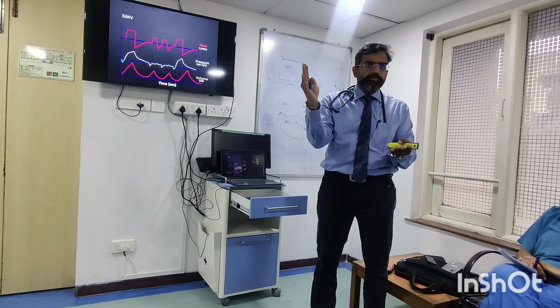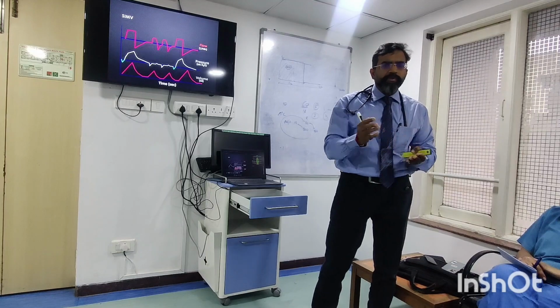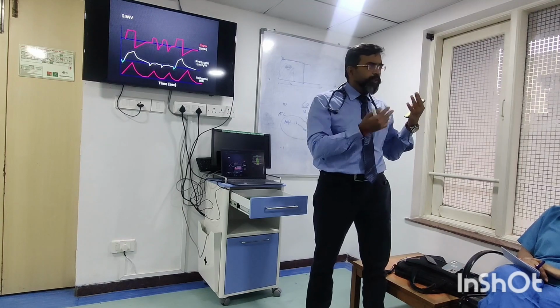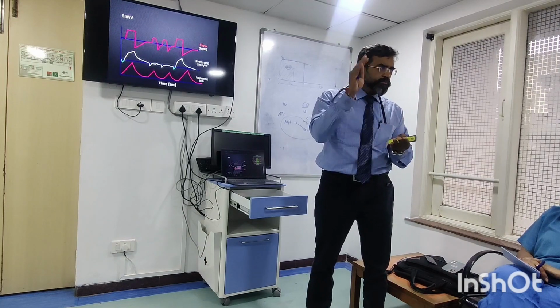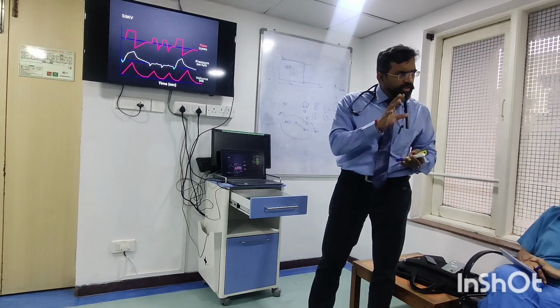The ventilator just works like that, and air from outside or oxygen attached to it goes into the patient. Irrespective of where the patient is, whether the patient is trying to breathe, taking a breath, or expiring, it keeps on going like a machine. There is no synchronization at all. Okay, this was what the initial thinking was.